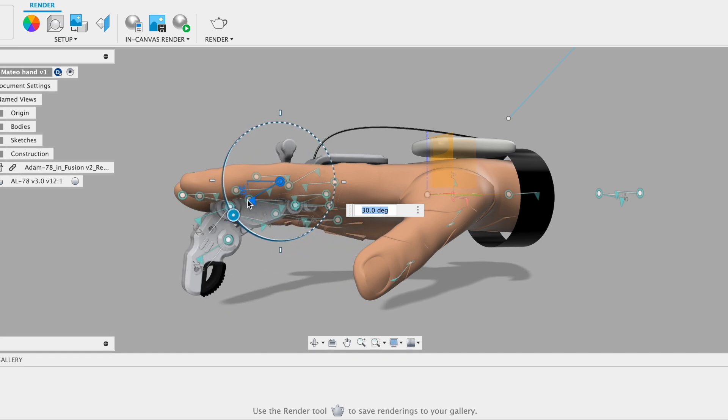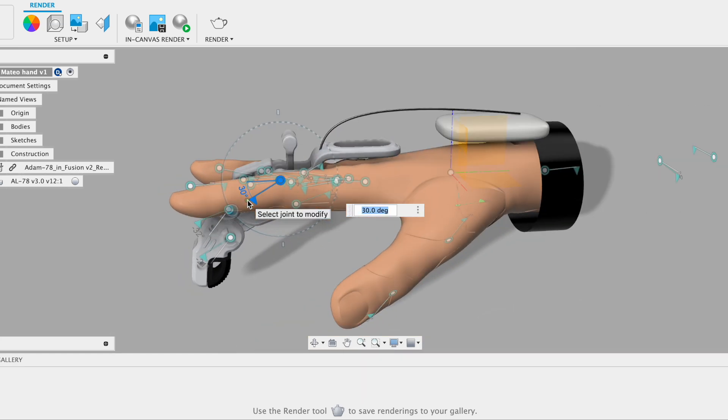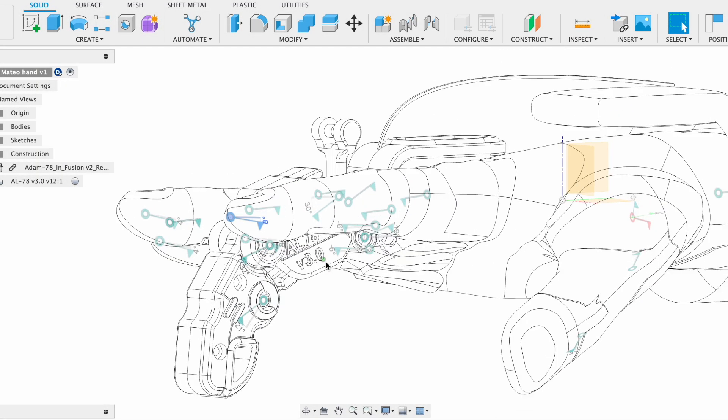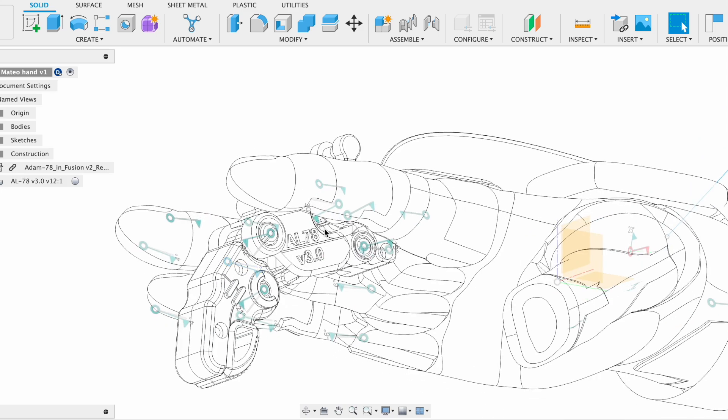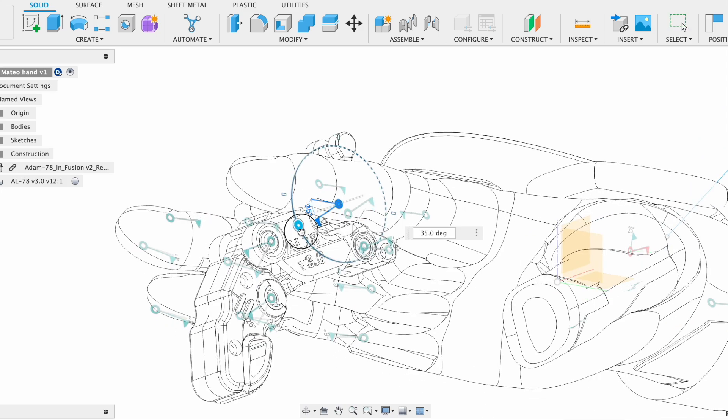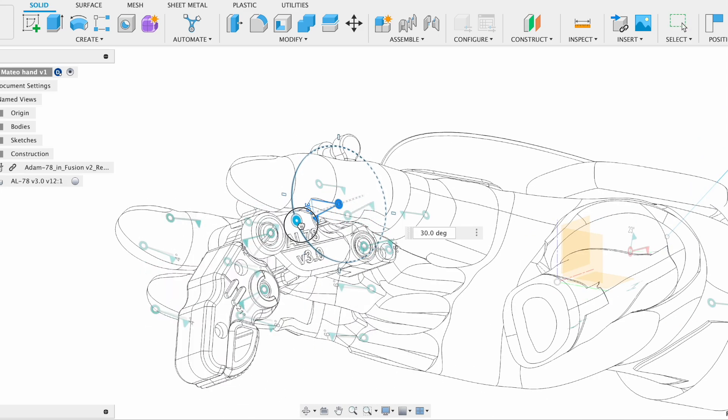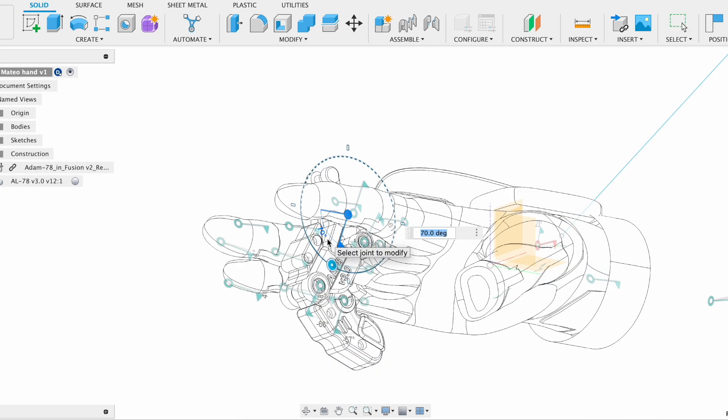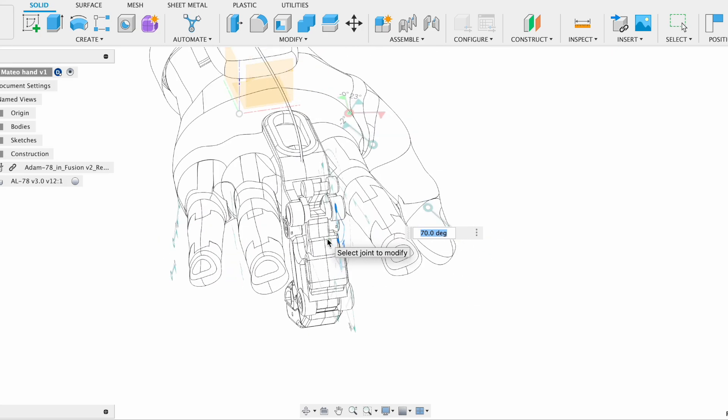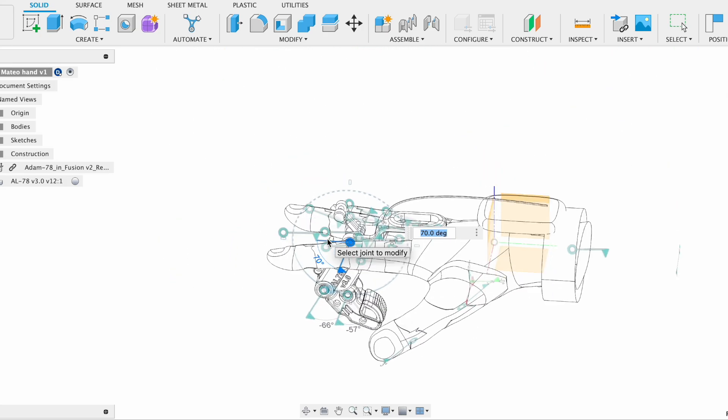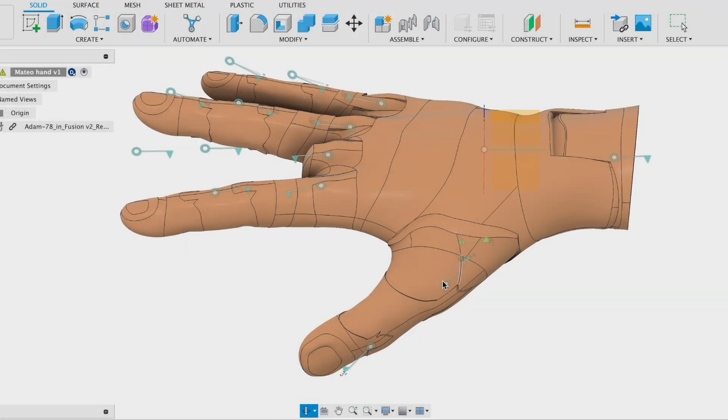As you can see, we have a functional prosthetic finger designed from previous videos, and in this case our user has amputation on the middle finger. So we have to use the movement from the wrist.